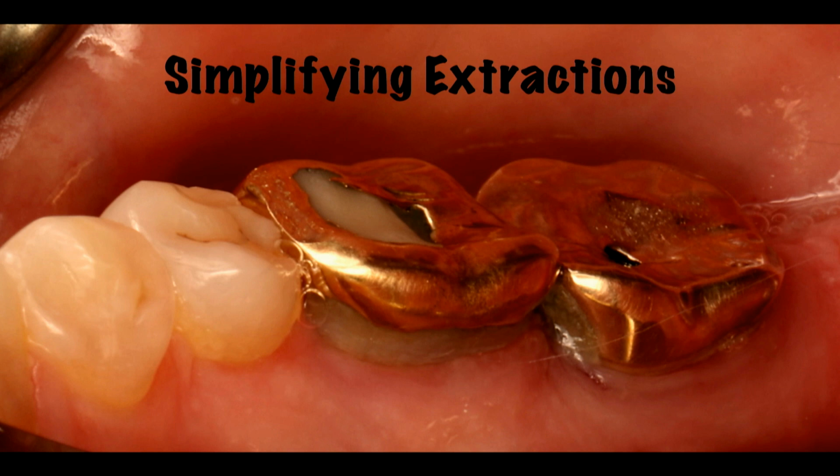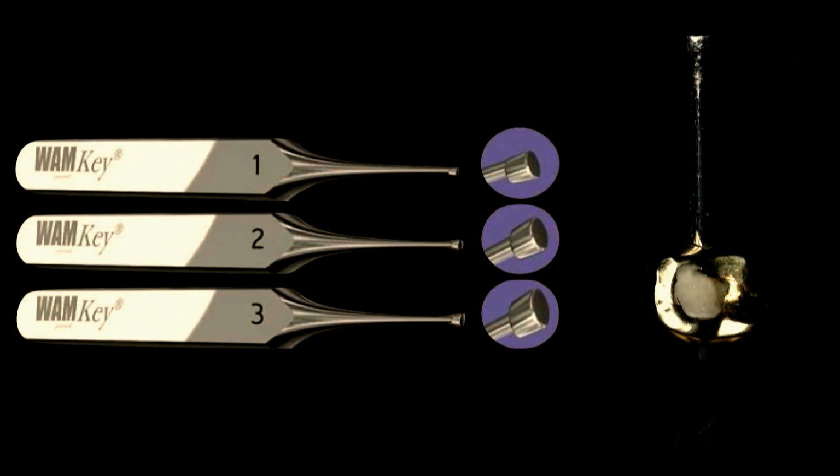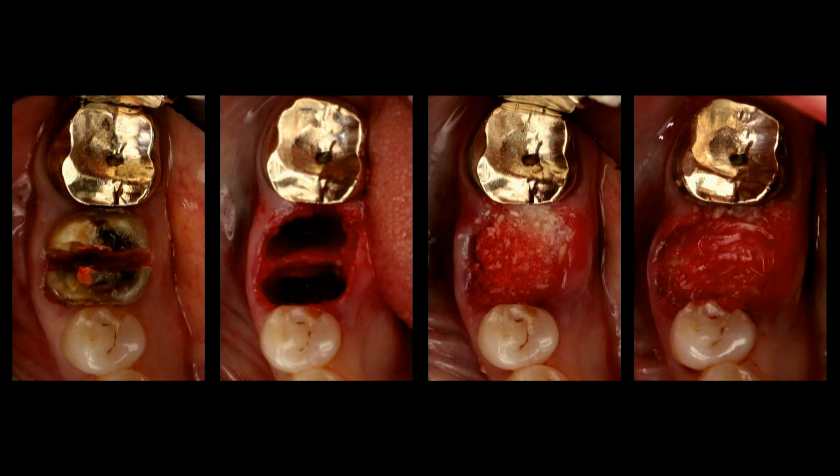And nearly 20 years into my career here, I'm about trying to simplify things. What can I do to make my life easier, work smarter, not harder, when possible? And here I went ahead, and I do this quite often. I use a WAM key to go ahead and remove a restoration if possible, just to keep the area cleaner and make it easier to go ahead and section a tooth.